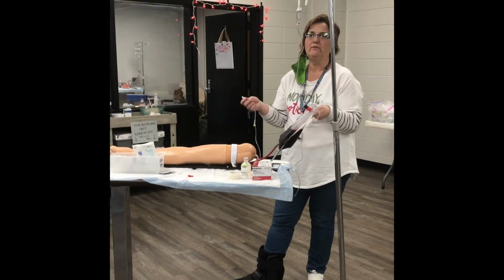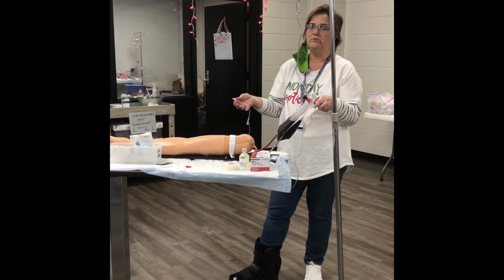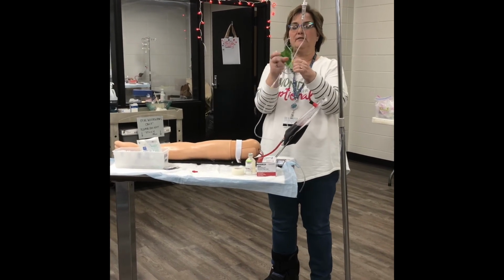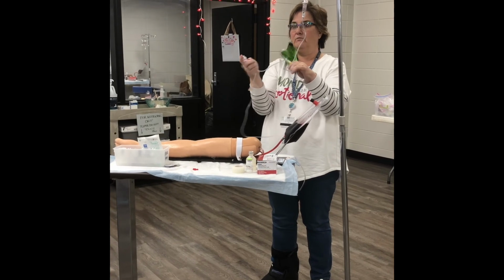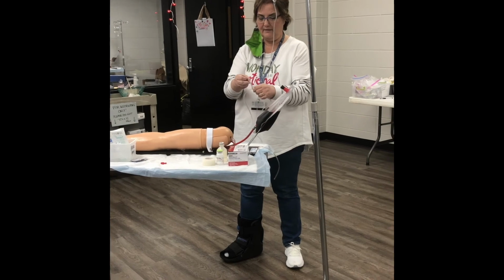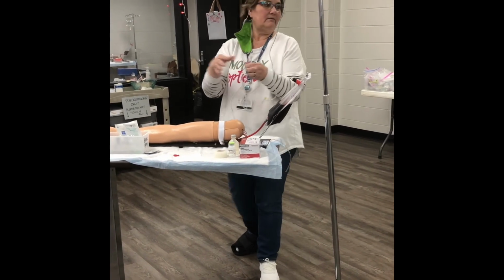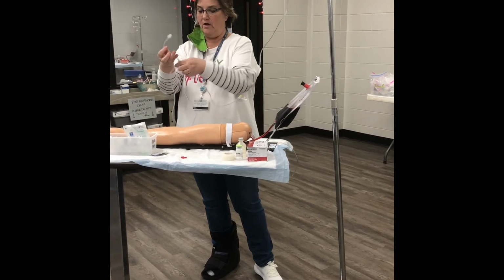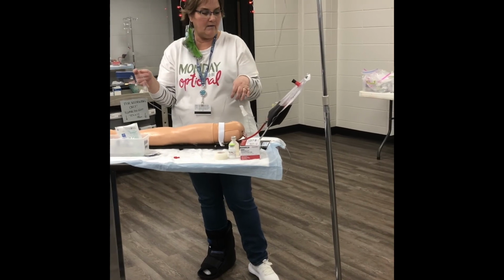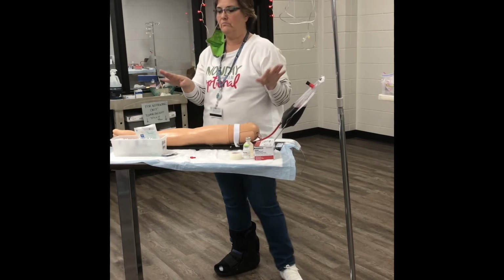If you do it slow, you can watch it kind of come down the tube, and you won't lose any. I'm going to do it really slow because I don't want it to go. As it passes each one of these, just see that go? If all of your ports, you'll thump them, yeah, and then you would let it go. I don't have a garbage can here, but that's okay, I'm done. You would let it go till all the little air bubbles that you had thumped out go into the garbage, or the sink, or whatever.